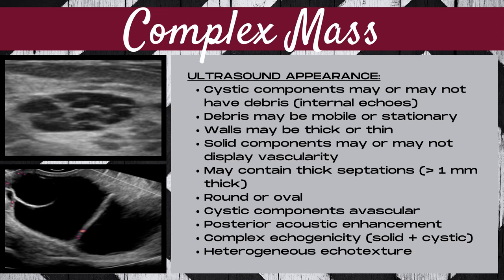A complex mass is generally round or oval, and the cystic components are generally avascular. However, mobile debris within the cystic components can mimic the appearance of a Doppler signal on ultrasound. Complex masses generally have posterior acoustic enhancement and will display a complex echogenicity with both solid and cystic components, as well as a heterogeneous ultrasound echo texture.